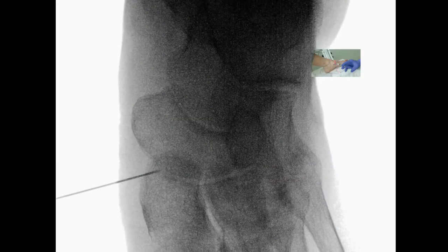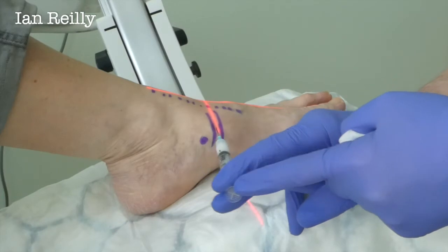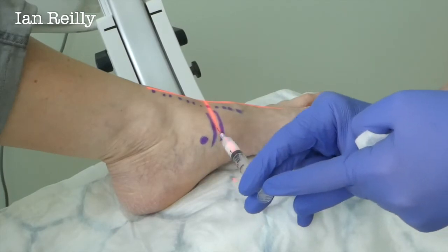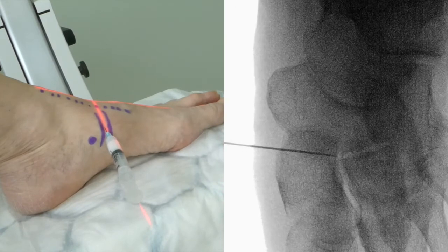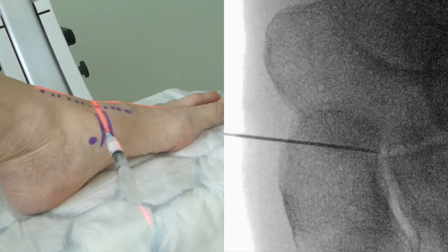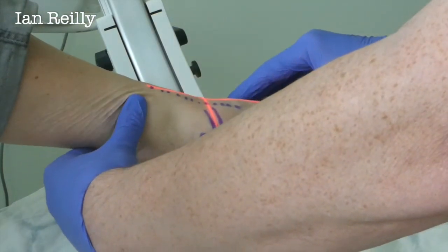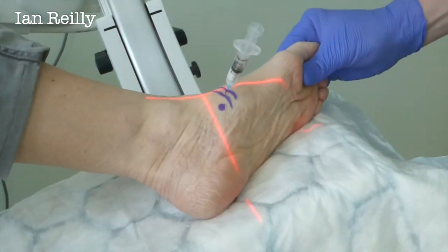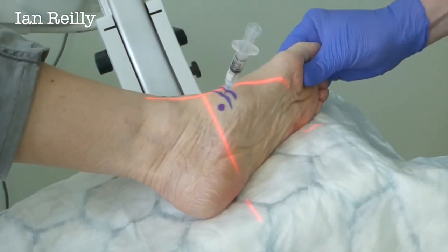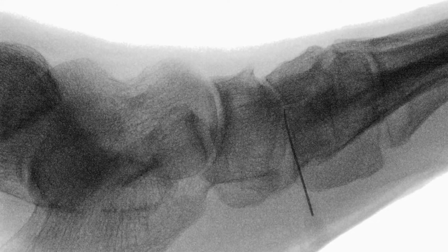We're really, really on it actually. I'm just going to angle that slightly to see if I can find the joint. Do you feel that going? Yeah. So on that view it looks to be slightly low, so what I'm going to do, Kathleen, is rotate that foot out and do a lateral view. And that's right in it — so I'm going to do a little video of this. On one view it looked like we were missing the joint, but when you look on the other view it shows you it's right in.